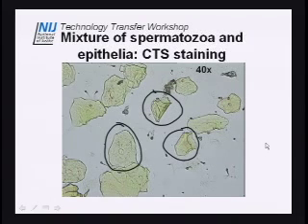And of course, with laser microdissection, we're especially interested in the nucleus. So the nice thing about Christmas tree staining, and even though this picture isn't very good, that nucleus generally will be stained red, and so that helps us to identify that nucleus and cut it out.